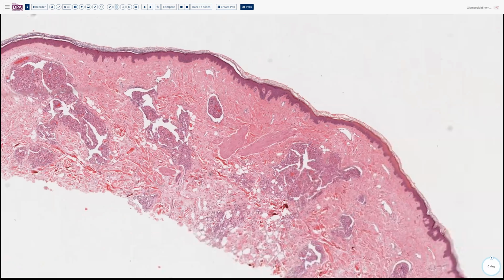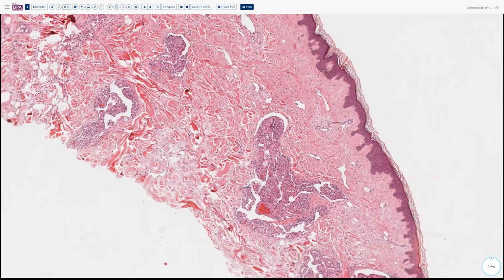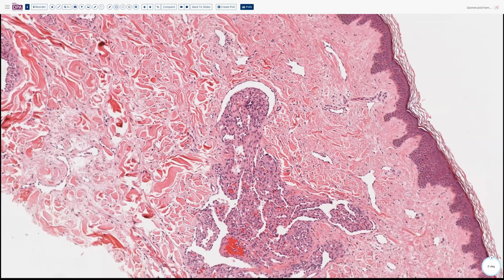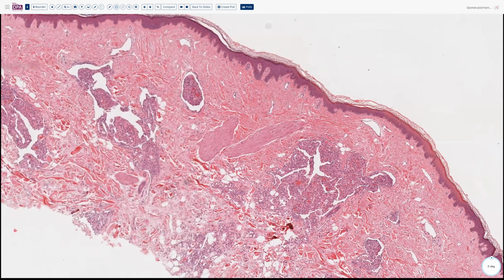And you can see they're sort of all over the biopsy fragment. You can see that this would present either as some sort of a slightly punctated plaque-like lesion with these variable intraluminal papillary projections, and sort of this pseudoglomeruloid appearance with an intravascular type of lesion. So very distinctive morphology. It's multifocal, so distinguishing it from the Masson's lesion doesn't have the association with secondary phenomena that we would think of with those. And so it has a fairly distinctive morphology.